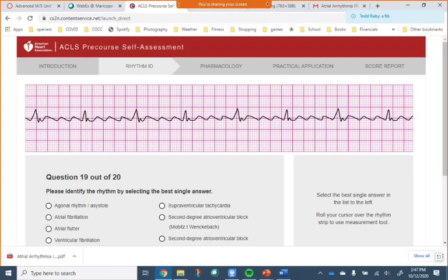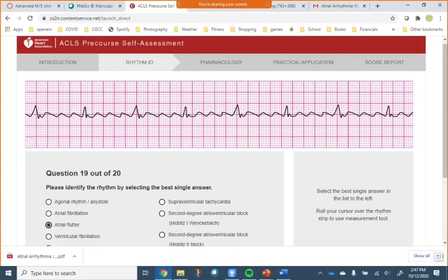It sure is. That's a 3-to-1 flutter. What that is showing you is not fibrillation, flutter. Each one of these, they are all P waves. They are fluttery P waves. Yes, there are P's before every QRS, but there's 3 of them. There's 3 P's before every QRS, and it looks like that sawtooth pattern. It is atrial flutter. Good job.